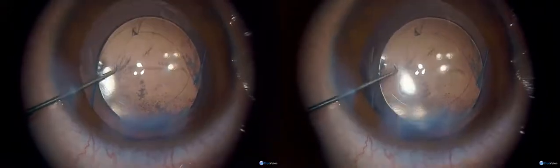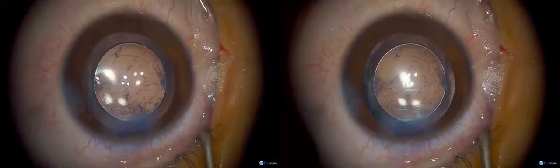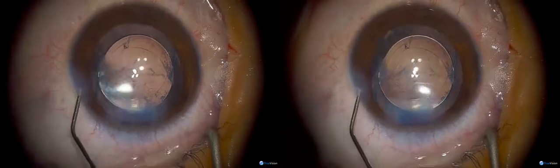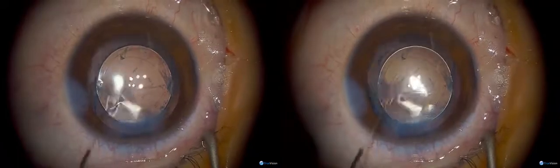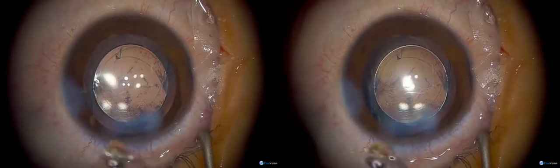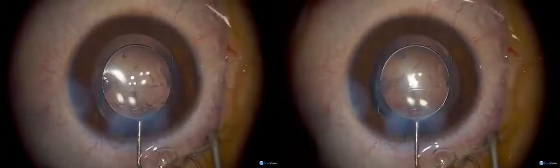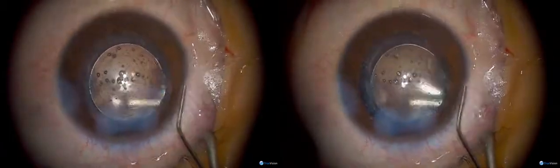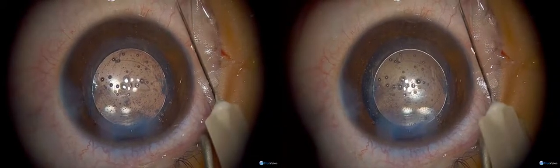How old is the patient? Seven years old. So he either had a congenital defect in his posterior capsule or he must have had trauma. That was why he had a cataract in this eye — he's obviously got a tear in his posterior capsule. My guess is it might have been due to trauma because firstly his mother said the cataract came on very quickly, and the other eye is completely normal with no other reason for the cataract. So it would explain everything if he had a recent trauma. I'm just going to give him half the dose of subconjunctival injection.